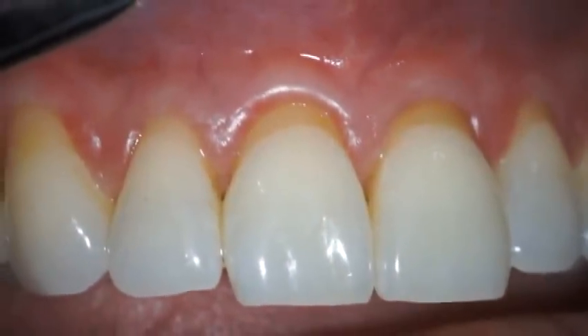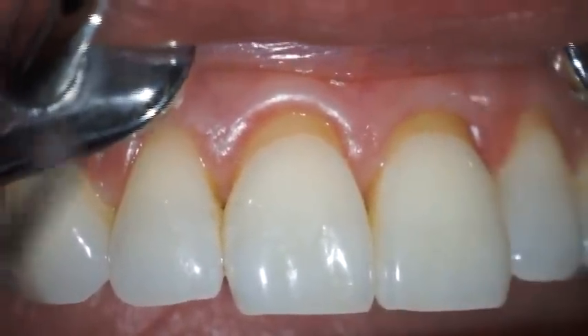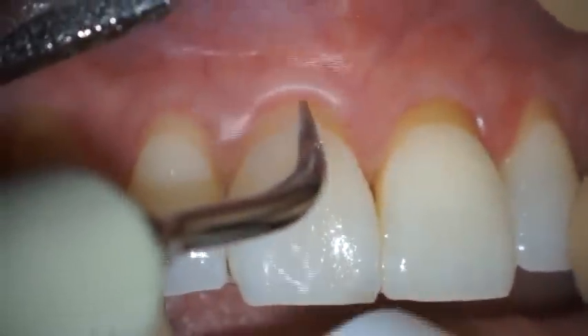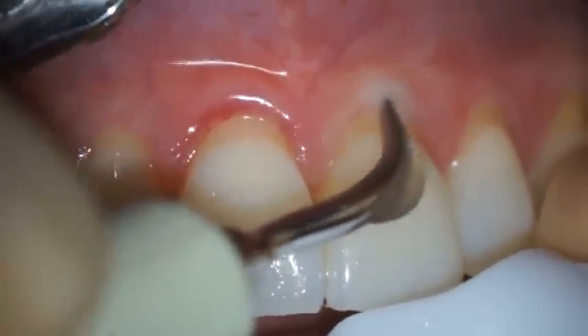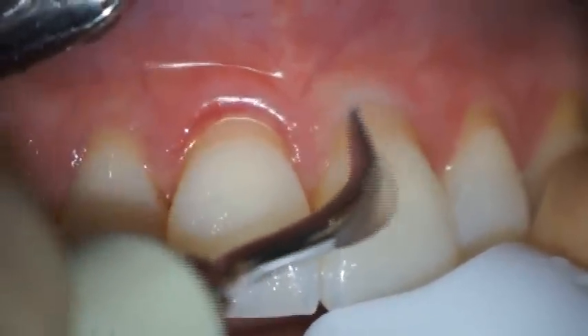Initial preparation of exposed root surfaces includes thorough scaling and root planing, as well as odontoplasty to reduce any cervical prominences of roots that extend beyond the confines of the alveolar housing. Root preparation begins with ultrasonic scaling of the exposed root areas using a fine-tip scaler. Care is taken not to traumatize the marginal gingiva.